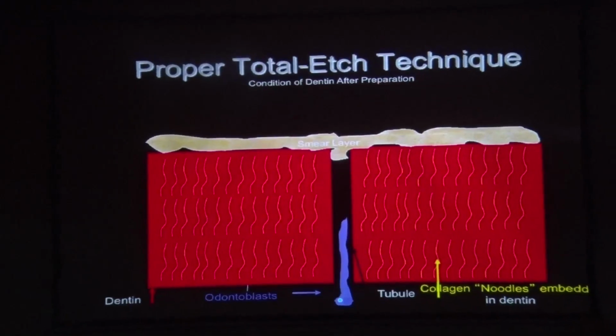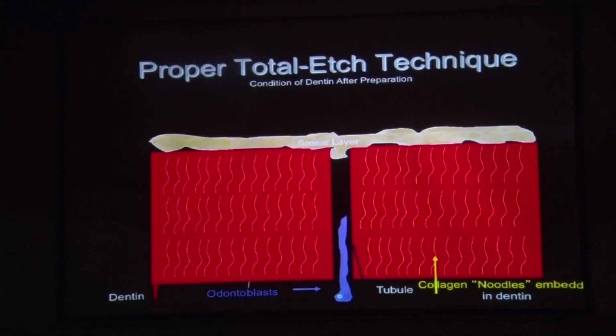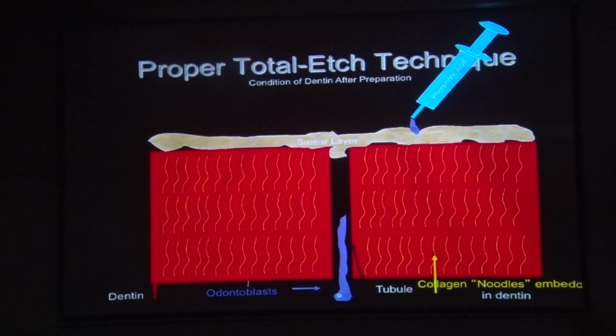Now when you're using a total etch technique, that means you are using phosphoric acid. You can use phosphoric acid between 30 and 40%, anything is okay. But how do I select an etchant? That's a very critical aspect. You have hundreds of manufacturers selling etchant, but you should know which etchant is best for you. It's the viscosity. You should control it; the etchant should not control it. You'll find many etchants in the market where you push and it just flows everywhere. That way you really cannot practice adhesive dentistry. Be focused. These are key things, because this is going to keep your restorations for long.